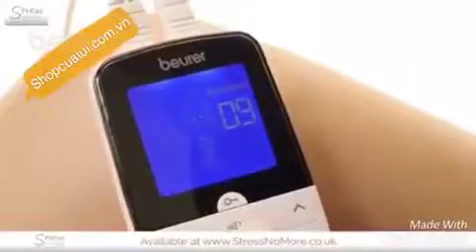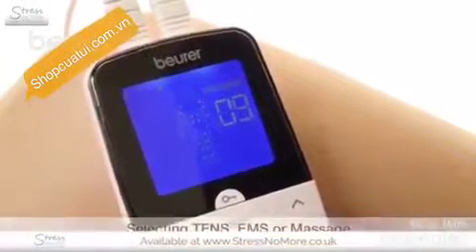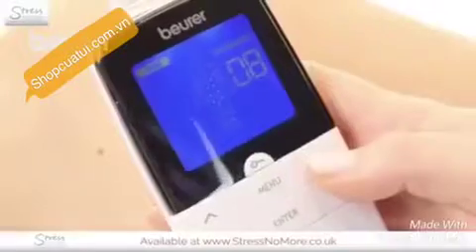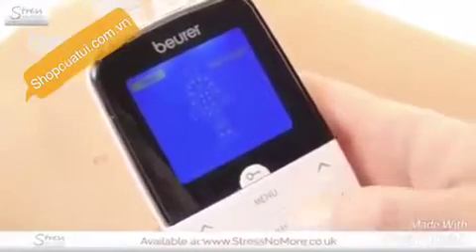Pressing the menu button allows you to navigate through the submenu. Select TENS, EMS, or massage mode using ENTER. Select the desired program using the up-down buttons and confirm with ENTER.